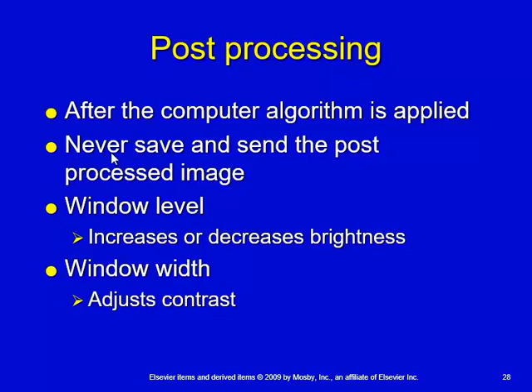Sometimes you have a tendency to want to manipulate your image, adjust the contrast, adjust the density, see if you can make something stand out a little bit more. And that's fine if you do. Just make sure that you save the original, and don't overwrite the original with new post-processing. Post-processing is your window and leveling.